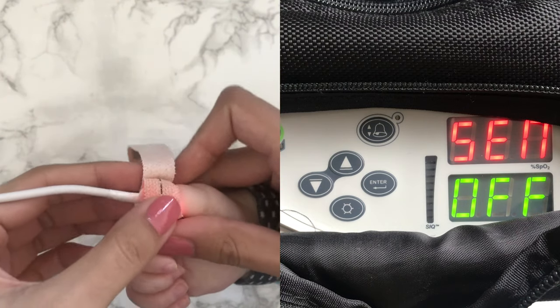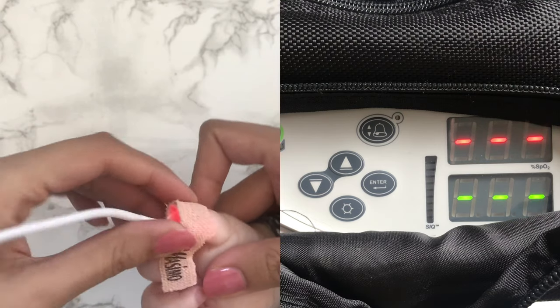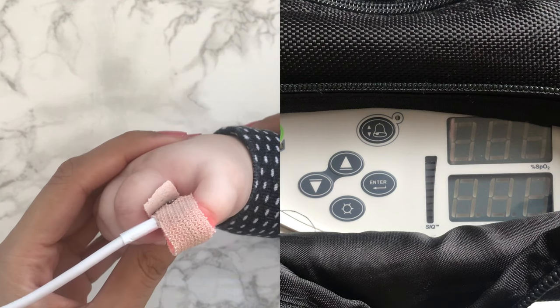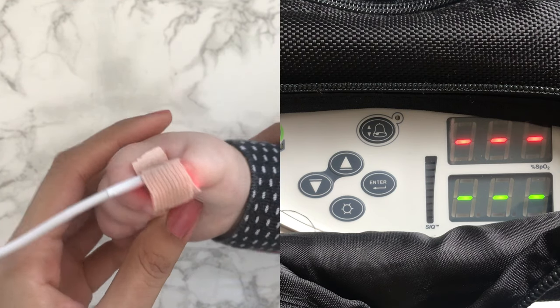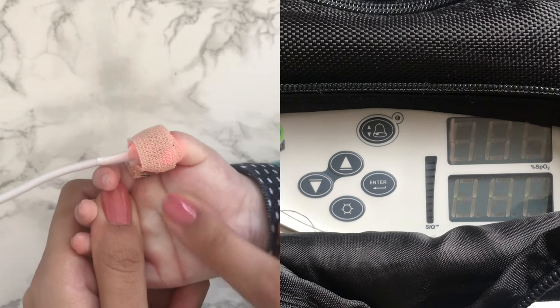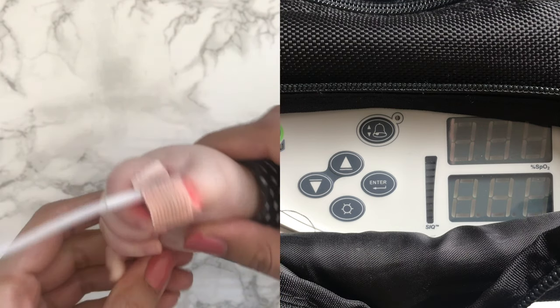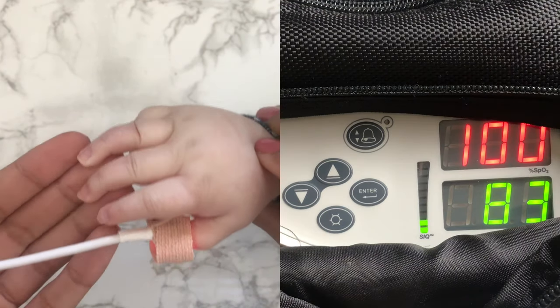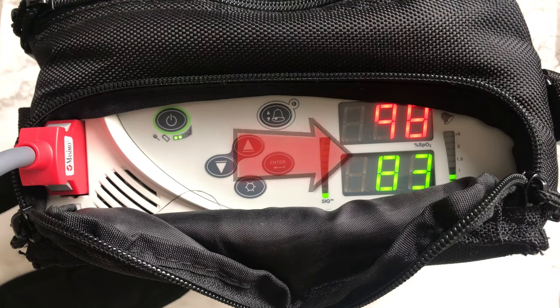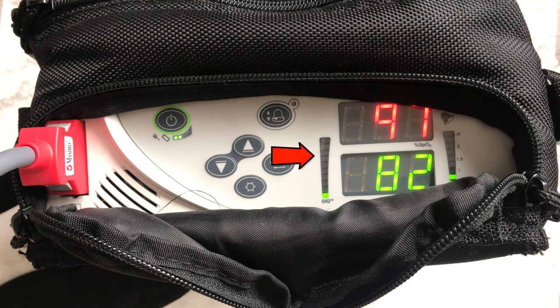Once you've placed the sensor on, the display will begin to show dashed lines until it picks up the signal, which can usually take up to 10 seconds. I've tried another oximeter brand, but I've found the Masimo to be the easiest to use as well as the most accurate. The top number indicates the level of oxygen saturation and the bottom is the heart rate. This bar indicates how true and accurate the signals are — it's green, so we're good.